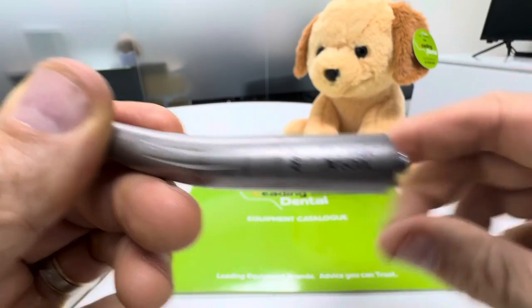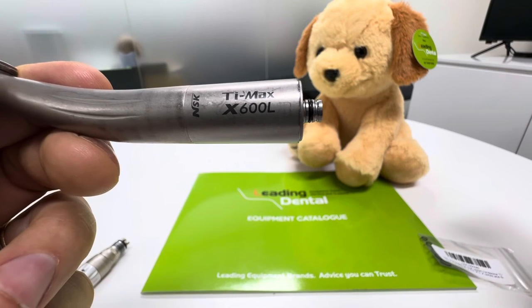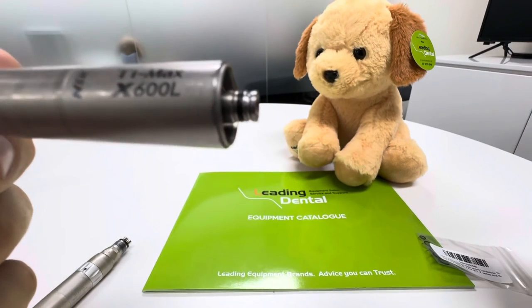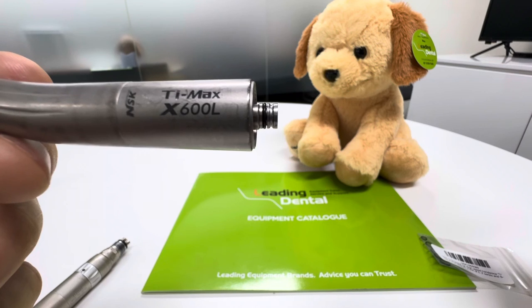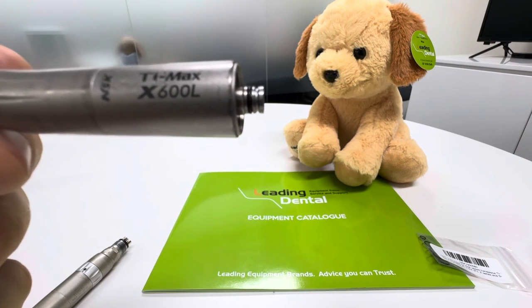Anyway, that's a bit of a 101. Obviously if you send the handpieces back to us for maintenance we look at those o-rings and a lot more, but that's just a simple user thing that you can do. If you've got any chips or damage on any of your o-rings it can be very detrimental — you can have water and air mix, loss of power, all sorts of things that will mean your handpieces aren't running smoothly.